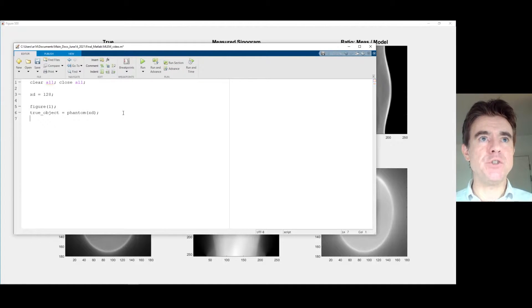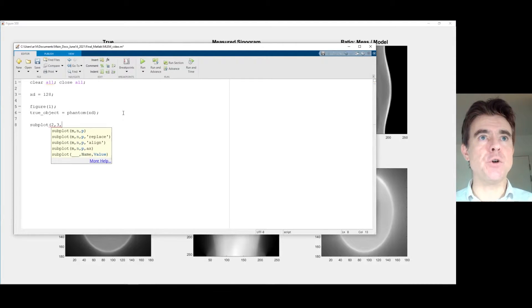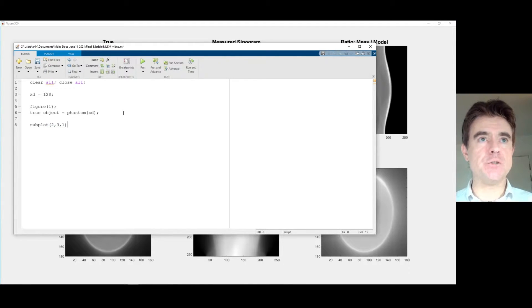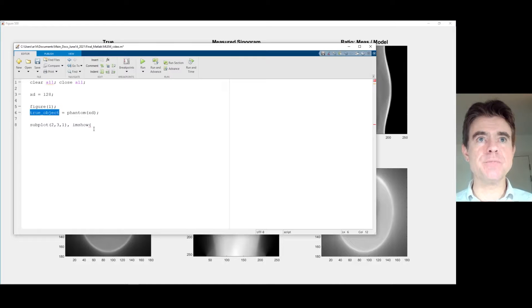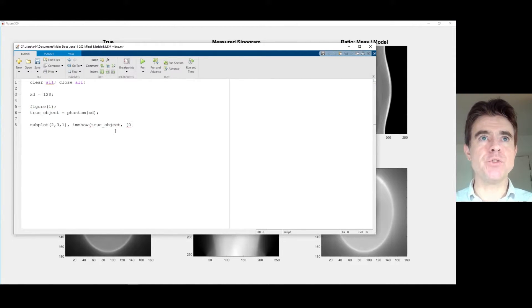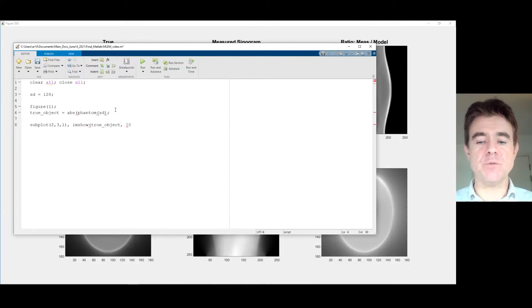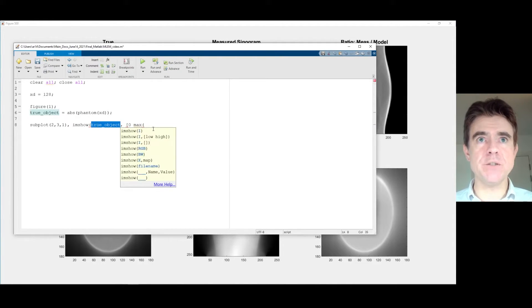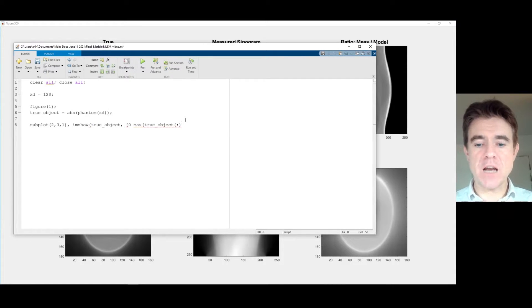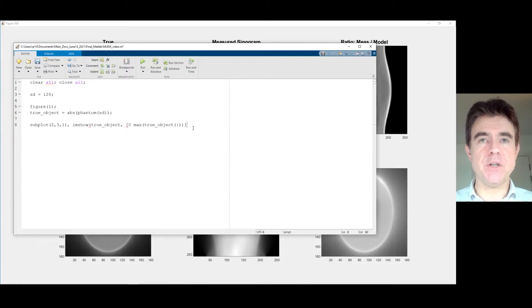Then we're going to just check that all is well. We're going to do a subplot to display — let's do two rows, three columns. The first panel in that collection of six panels will be an imshow of that true object. I should point out that the phantom in MATLAB often has negative values, so we're just going to take the absolute value of the phantom to make sure there are no negatives. We'll display the true object between zero and the maximum value.